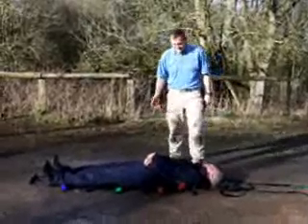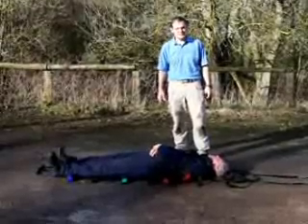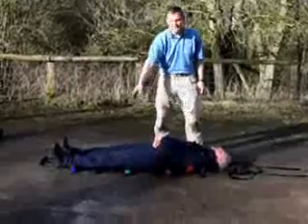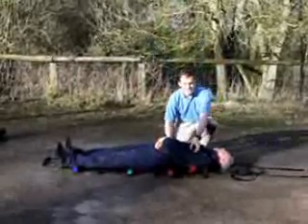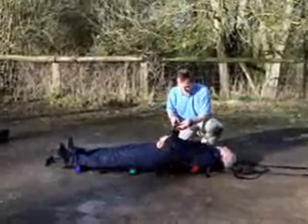Once a casualty is in a place of relative safety, we can secure them a bit better onto the teammate with the straps. You'll see the straps are colour coded — red, orange, green and blue — a bit like traffic lights. The first strap, the red one, goes under the arms, so the patient is secure if we're going up or down a hill.